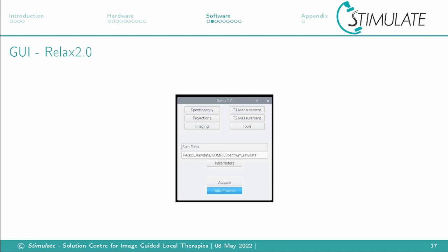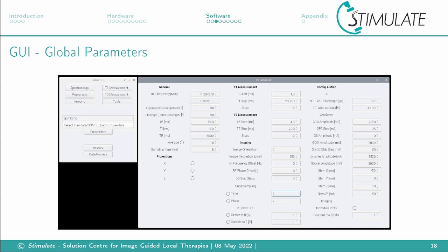If you execute the main Python script, a dialog will appear where you type in the RedPitaya IP address and connect to it. Then the main window will appear. Here you can select spectroscopy, projection, imaging, or if you want to measure T1 or T2 times. You can open the parameter window to set all your MR parameters like TE, TI, TR times, pulse lengths and amplitude, but also shim and gradient amplitudes.